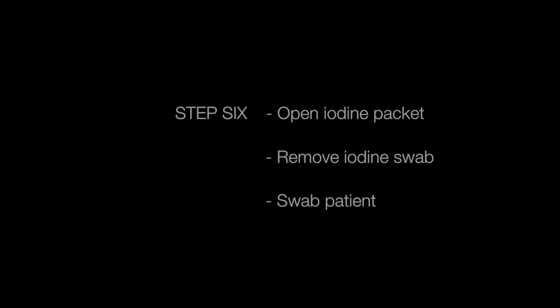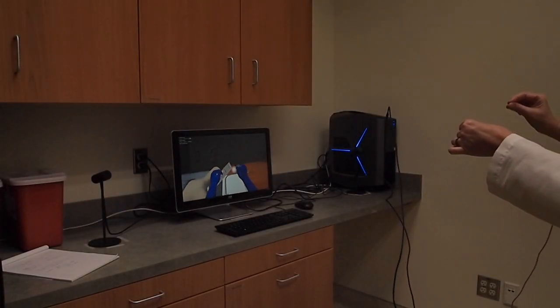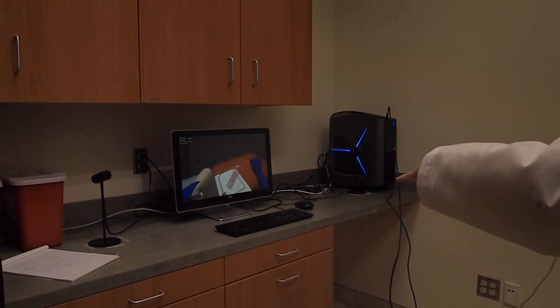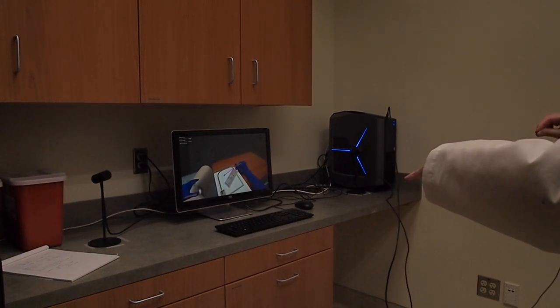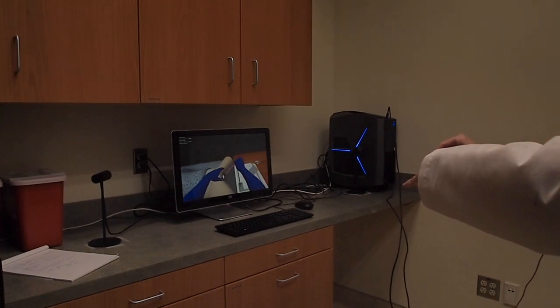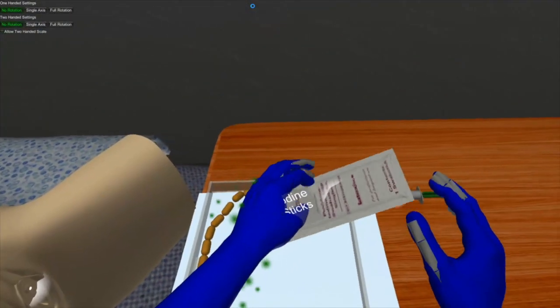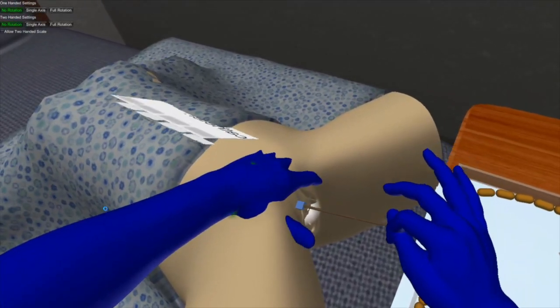Next, we will sterilize the site with Betadyne swabs. First, pick up the packet, then tear off the top using the glowing tab. Place your hand on the patient and use each swab once with a front-to-back motion, throwing away each swab as you finish with it. Notice that the sides of the site are swabbed first and the center last. Pick up and place the swabs, remove the top, then swab the patient using sanitary procedure and throwing away the swabs as you go.